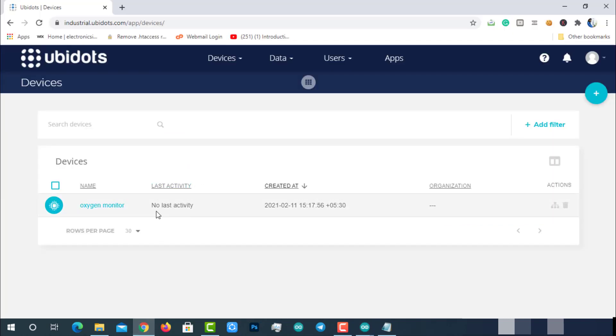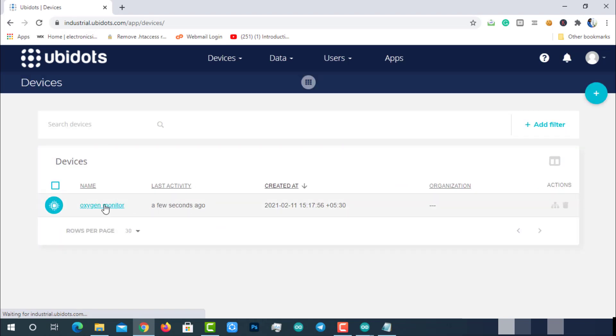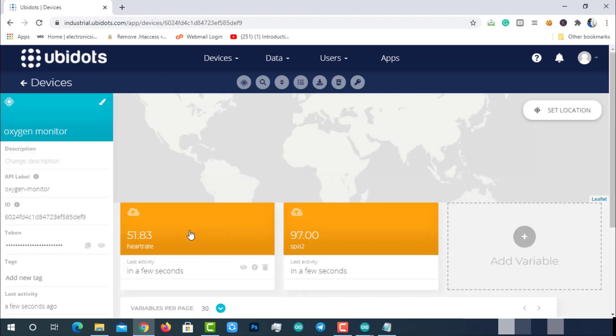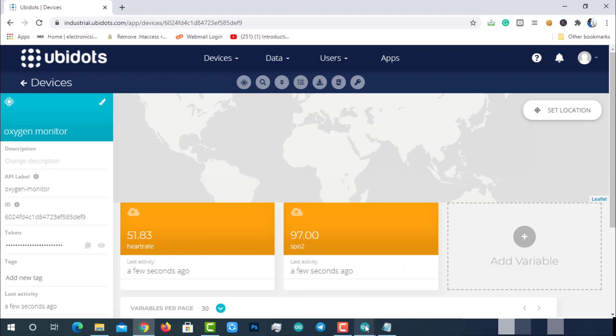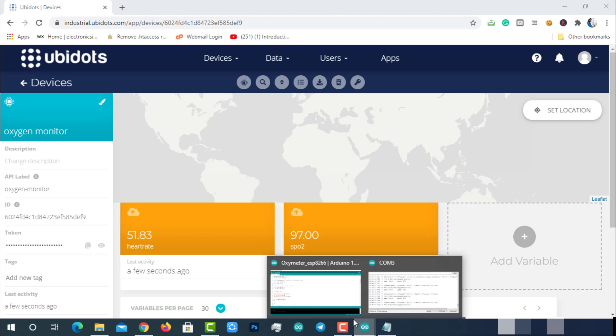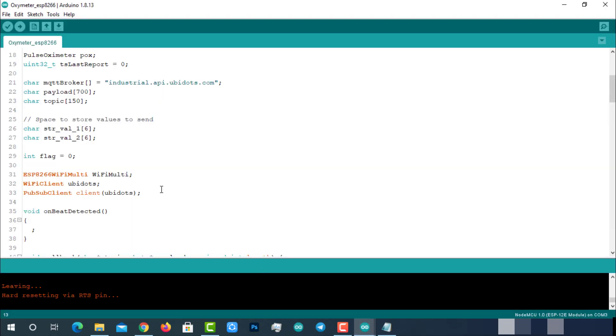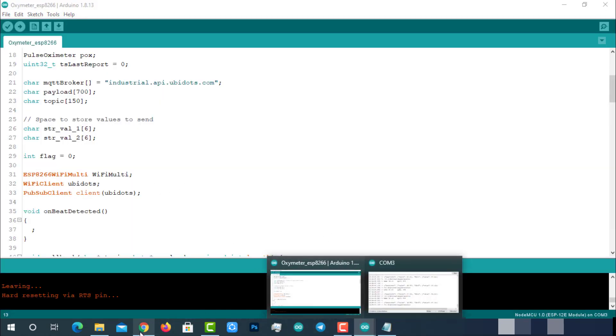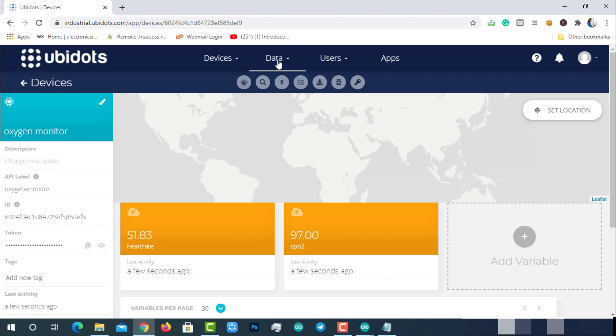Now go to Ubidots and reload it. You can see the last activity in a few seconds, which means our pulse oximeter is communicating with Ubidots. The best part of Ubidots is that if it receives data from any module, it will automatically create those variables and start storing data for us. Here you can see the same variables are created automatically. Currently we are receiving and storing the data on Ubidots.